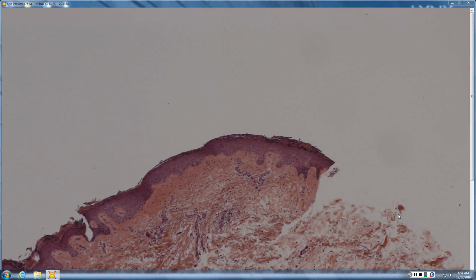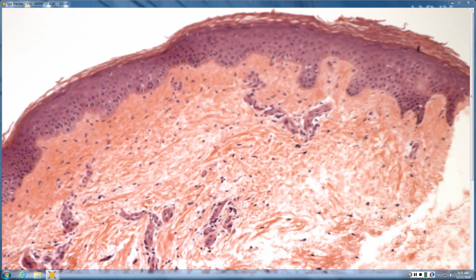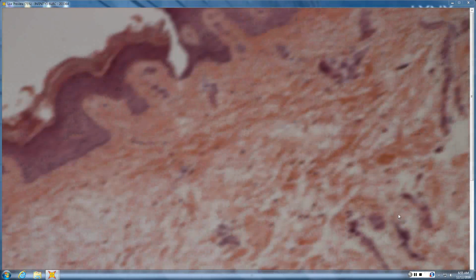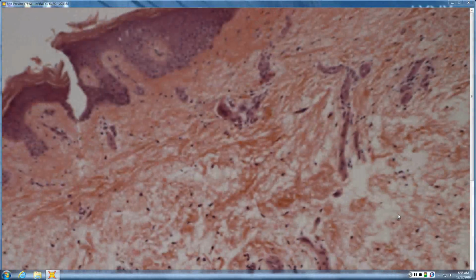So, you know how I was talking to you about that more subtle change? This is a good example of that more subtle change. All you kind of see is maybe some wispy collagen bundles in here and maybe some increased space between the collagen bundles. Right? But where is this one predominantly located, versus the last one? This one goes up probably, right? Yeah, more superficial, diffuse reticular dermis is where it seems to be situated.